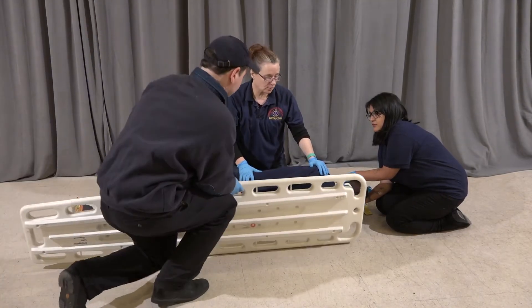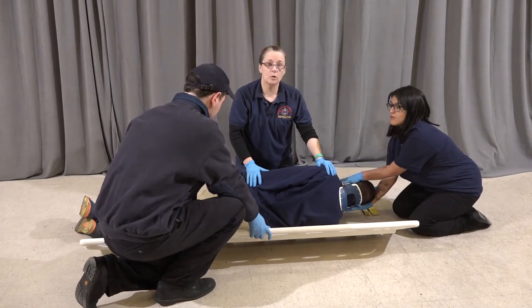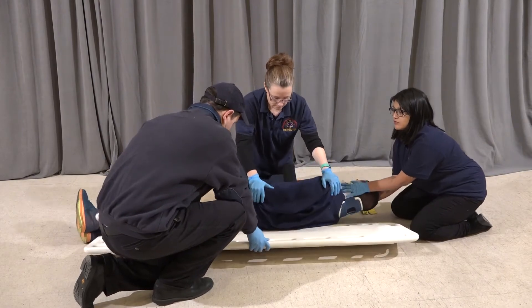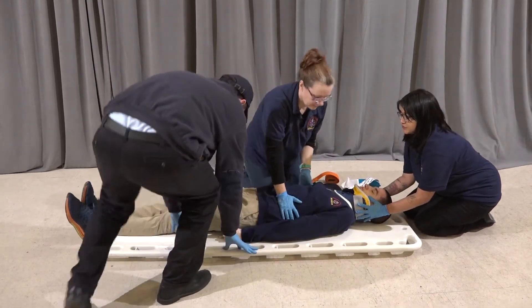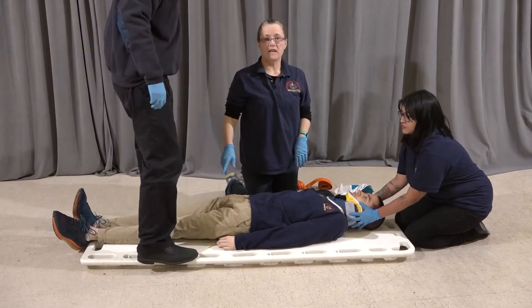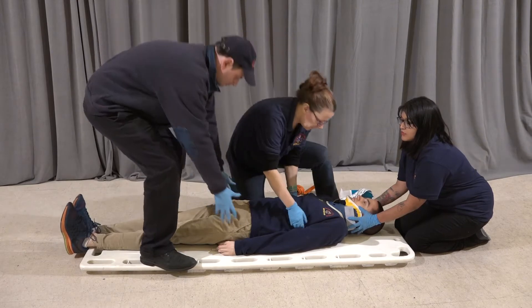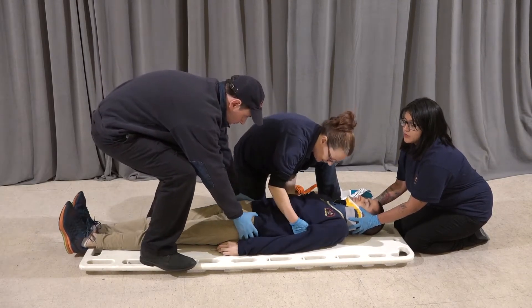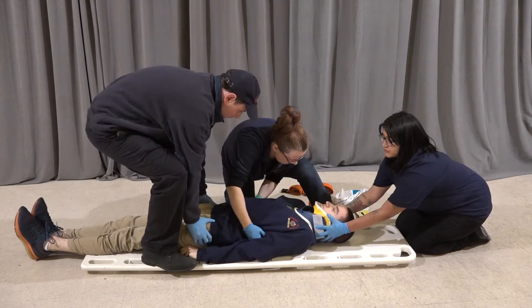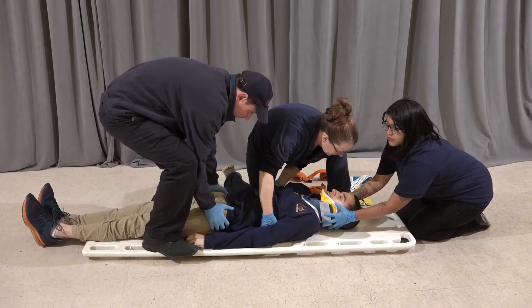Now we're going to insert the board. On the head's count, we're going to put the patient on the board. One, two, three. We need to center him, so we're going to move him in a V — going down first and then up. Ready? On the head's count again. One, two, three. And we're bringing him back up to the top of the board. One, two, three.